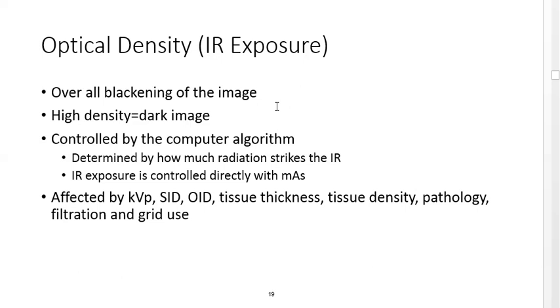If you remember tanning, tanning is a phenomenon where primarily the filament evaporates and coats the inside of the X-ray tube, adding more inherent filtration. So over the life of the X-ray tube, your image receptor exposure will decrease if your machine is not adjusted to account for the added filtration.